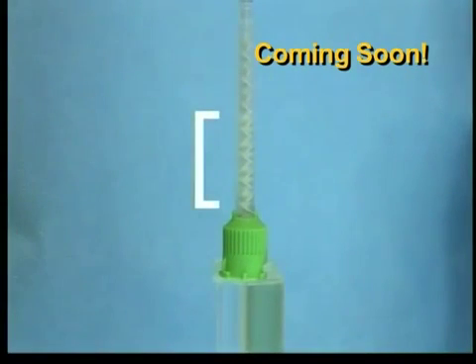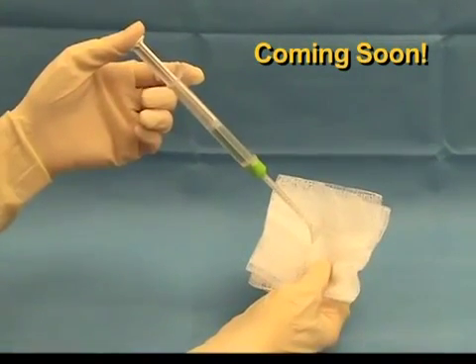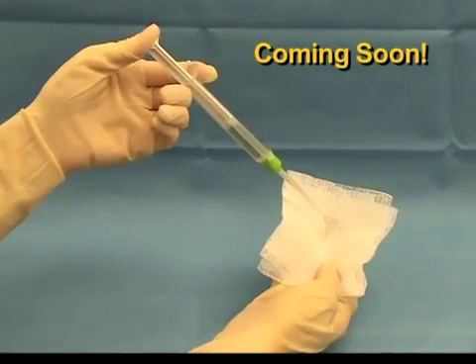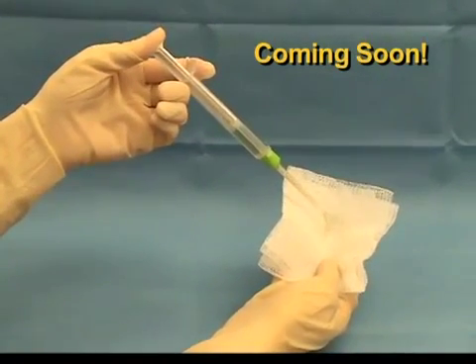The spreader tip will then become occluded with a small amount of BioGlue and will need to be changed prior to use. This method will result in two remaining working tips. Regardless of how the air is removed from the syringe, it is important that the surgeon prime the syringe immediately prior to application.